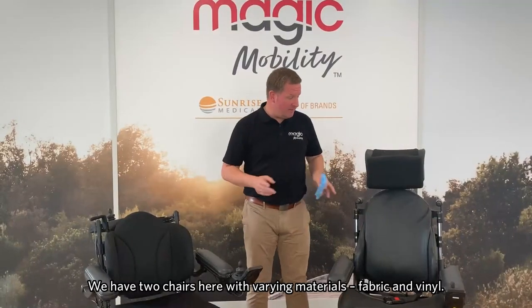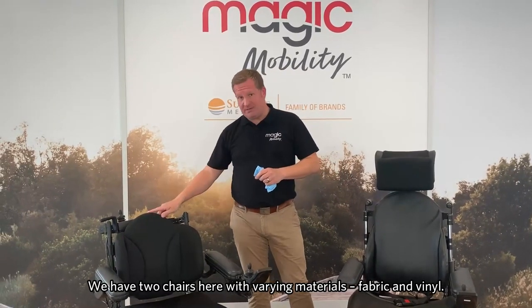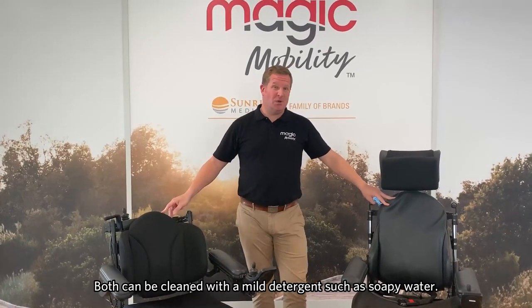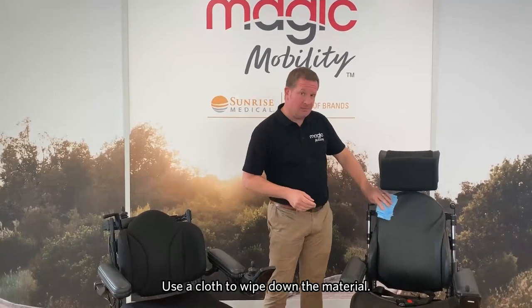As you can see here, we've got two of our chairs with varying materials. Here we have the fabric material and here we have an example of our vinyl material. Both of which you can clean with a mild detergent — soap diluted with water — and then generally use a cloth just to wipe down the materials.